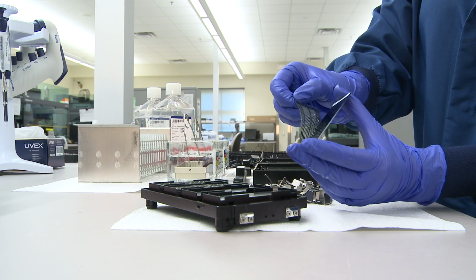The chip is the key to unlocking your genetic code because it holds a key ingredient, synthetic strings of DNA called probes. Probes are almost like strips of microscopic Velcro, but instead of being made of tiny plastic loops, these DNA strips are made of A's, G's, C's, and T's, the same letters your genes are made of. These DNA Velcro strips help us locate the parts of your DNA that are just next to the letters we want to read, called variants.